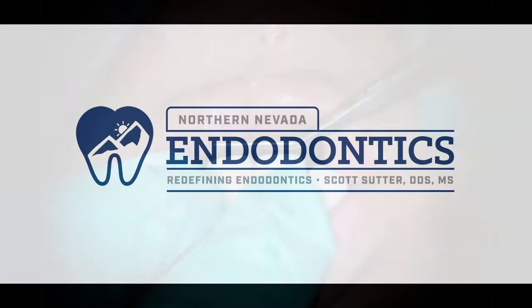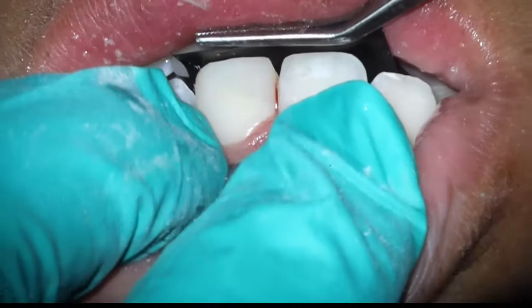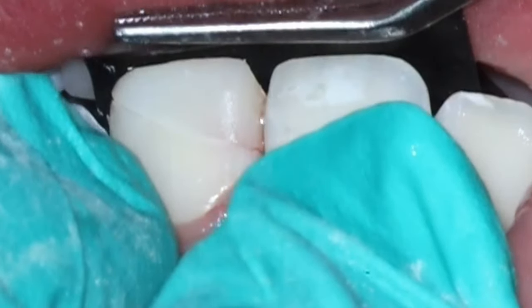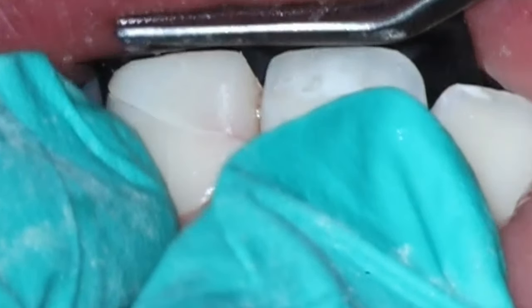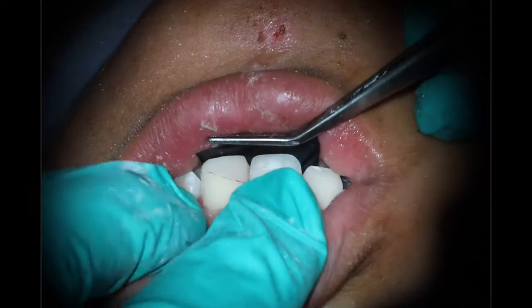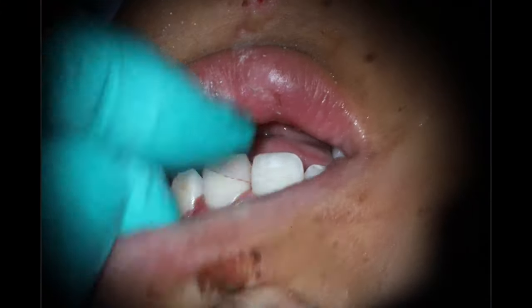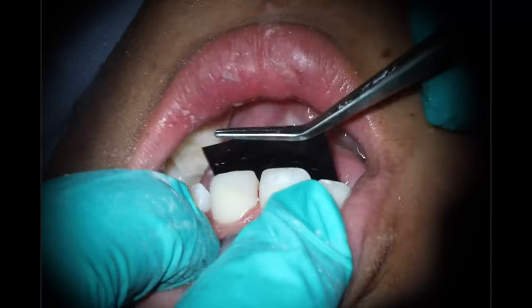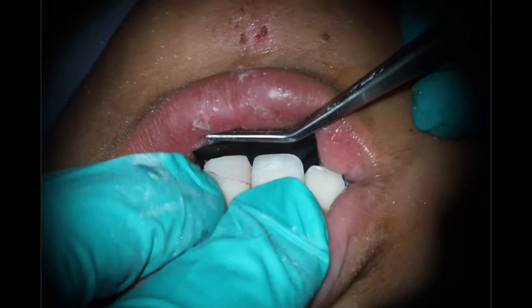And actually, it's not, because as he moved forward, he broke the filling off. That is the whole problem: because of that super deep bite, he ended up breaking that off. So what is going on here is a couple different things. The first part was that he had almost a complete overbite. So as soon as he started pushing forward and moving protrusively, off came the composite. That was the first issue.